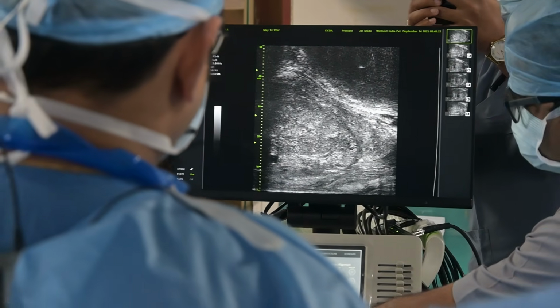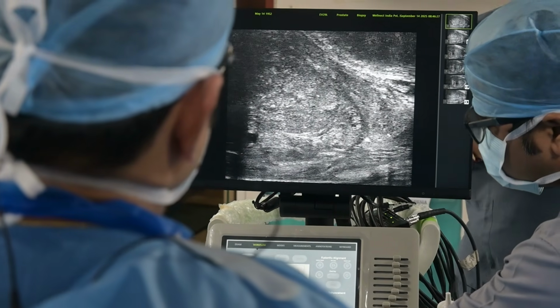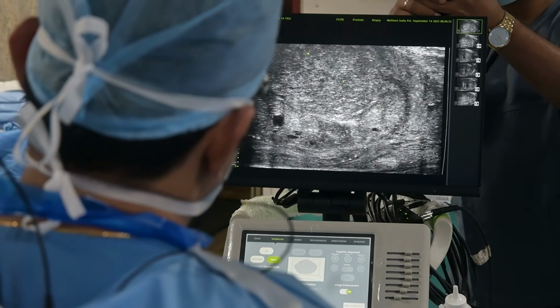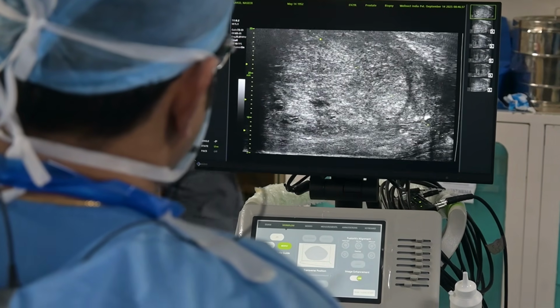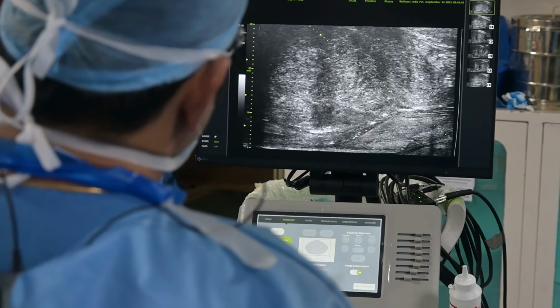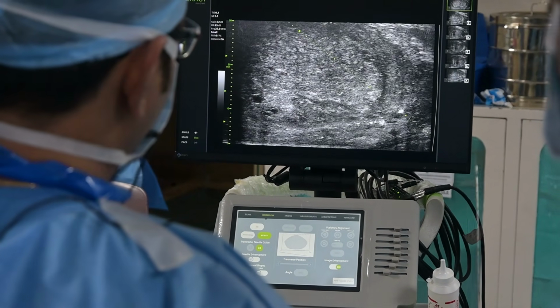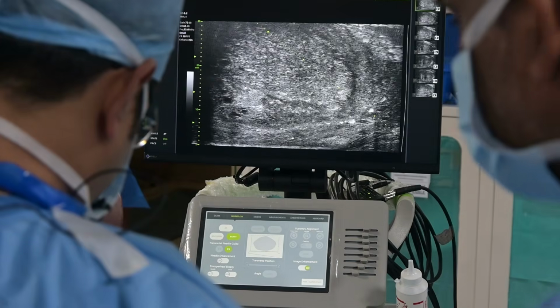Sir, how much is the magnification, more magnification compared to the regular BK that we use? So compared to the BK, you will get about 3 to 4 times more magnification in this. Okay. So, does this just have biplanar mode? It doesn't. It can give you a reconstructed biplanar mode, but necessarily you have to do everything in the sagittal. Okay, sir. So I will do the first targeted biopsy here from that area that you see.